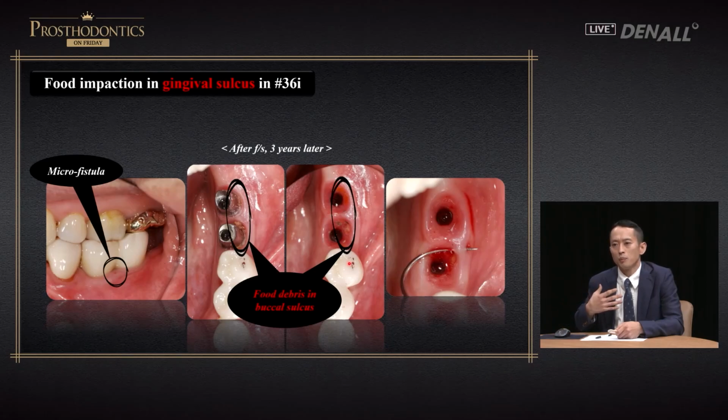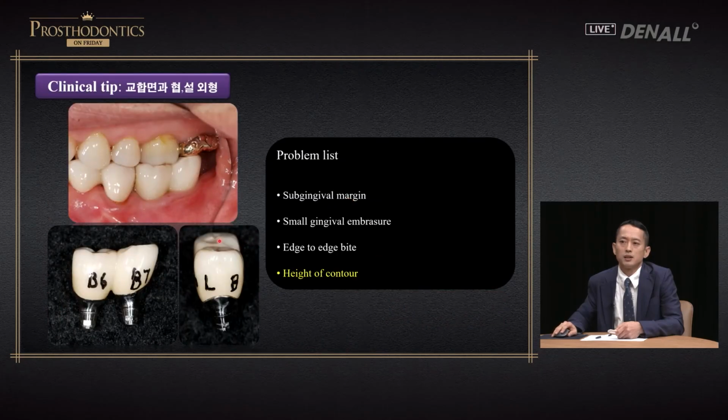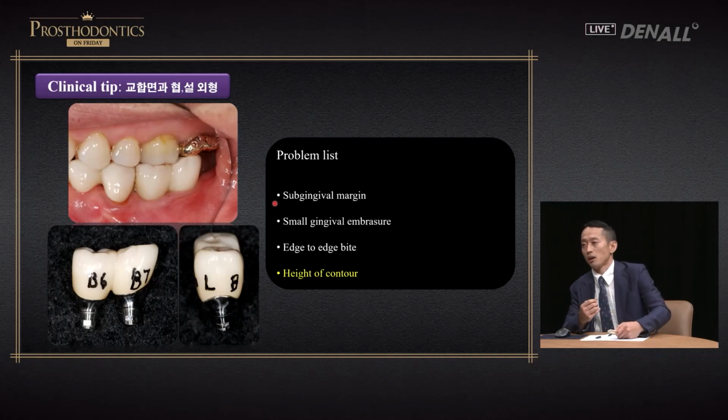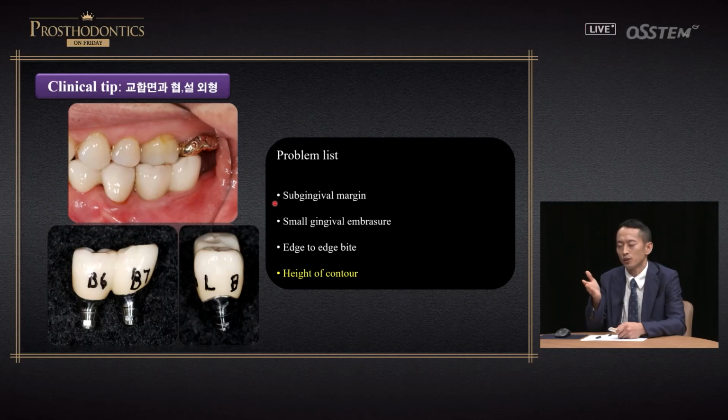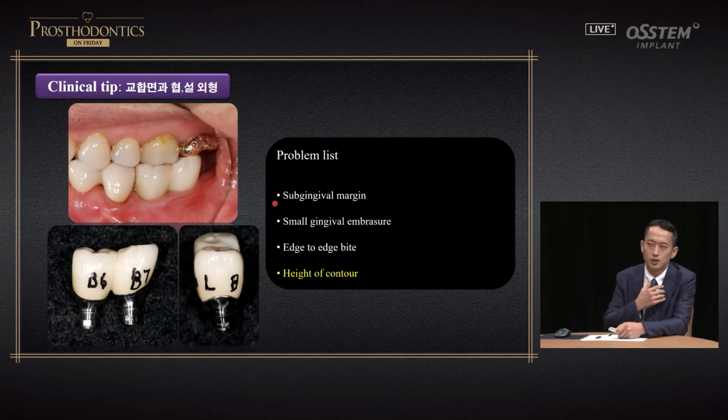This made me realize that my prosthesis was the problem. I removed the prosthesis and looked at it carefully. Those who have learned ahead of me, you may have learned the gingival protection theory. The height of contour, which is gingival third of tooth or prosthesis, prevents food from falling into the sulcus. So it does not irritate the gingiva and is not impacted in the sulcus.